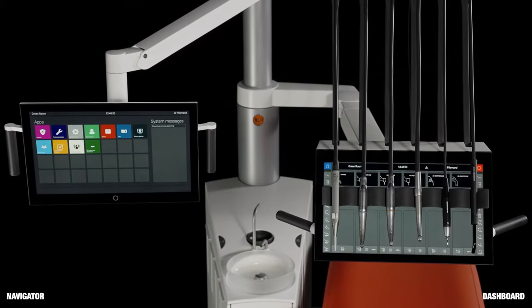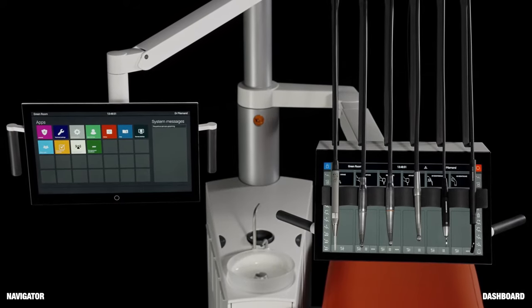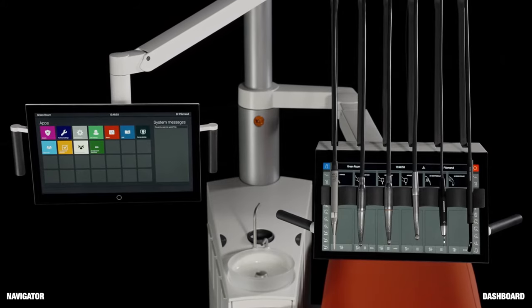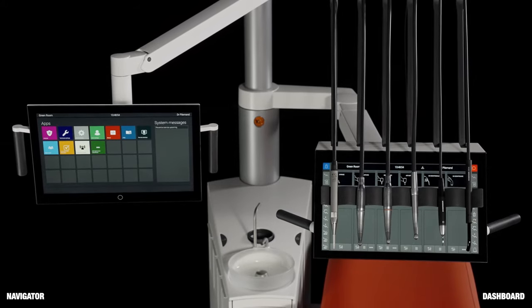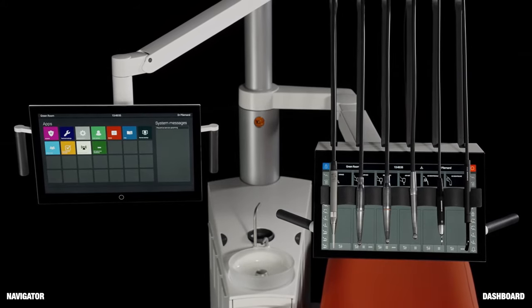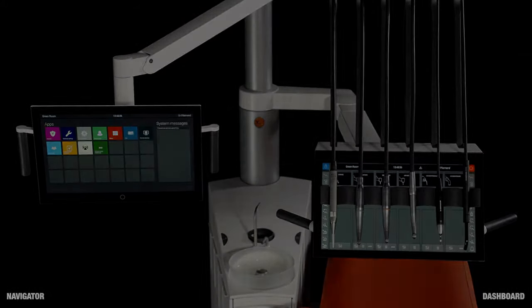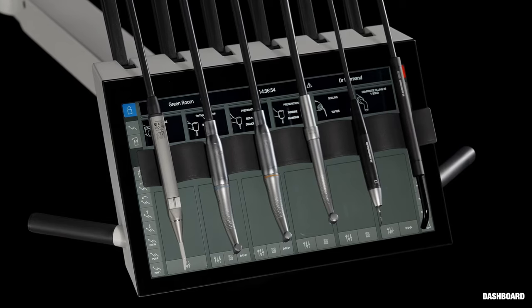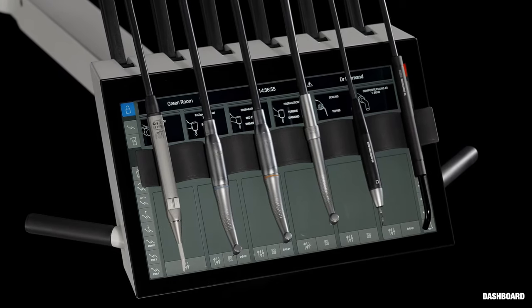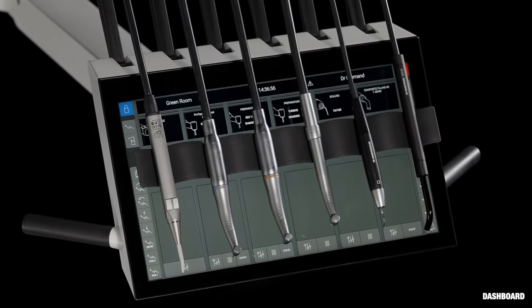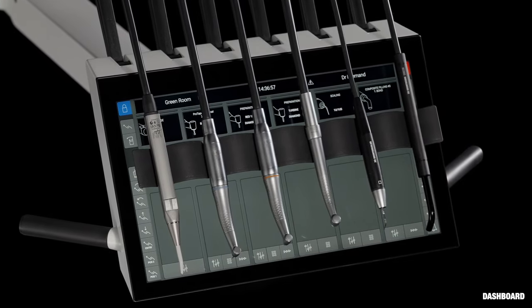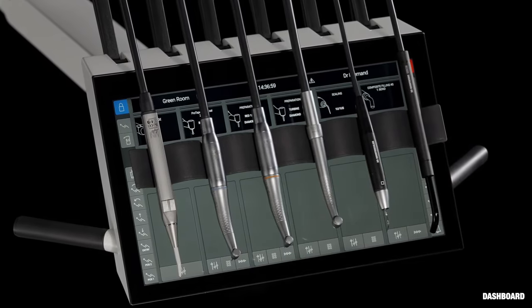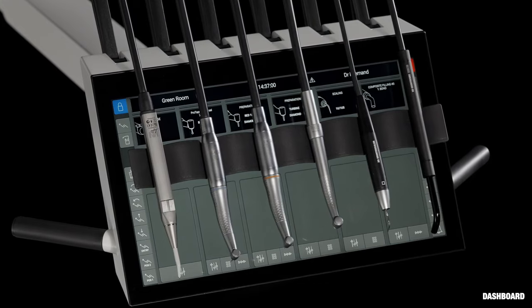ExoFlow is a digital dental treatment solution based on new technology not seen before in dentistry. One such example is the dashboard — a touch-activated graphical user interface integrated into the instrument bridge.